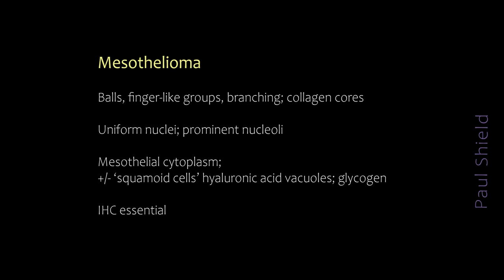Remember, these are well-differentiated tumours mostly, so the nuclei tend to be quite uniform and not show a lot of anisokaryosis. In fact, if you see a lot of variation in size and shape, you need to really start thinking harder and look for more adenocarcinoma features. Although the nuclei are fairly uniform, often they'll have very prominent nucleoli, just like adenocarcinomas, and they can mimic that closely. You will occasionally see large, bizarre malignant cells amongst a very uniform population.